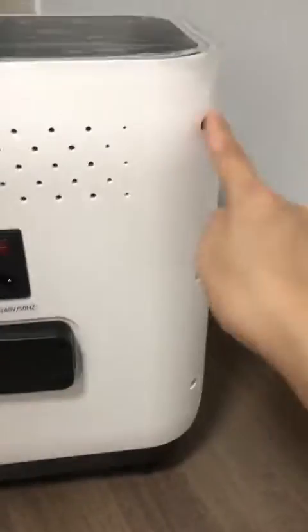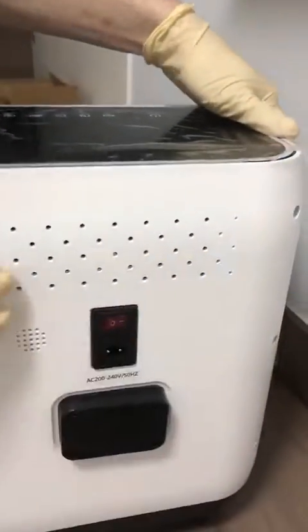Okay, there are six holes. One, two, three, four, five, six. Then you can open it.